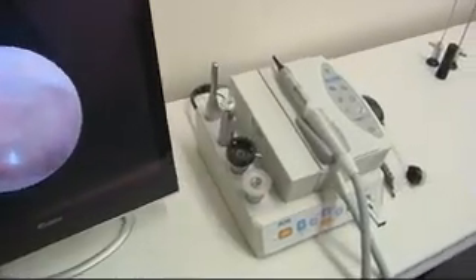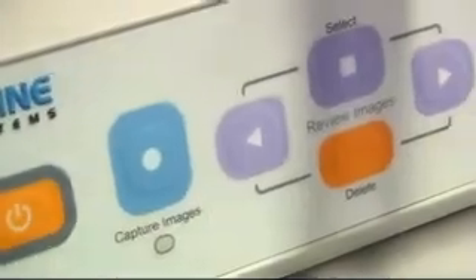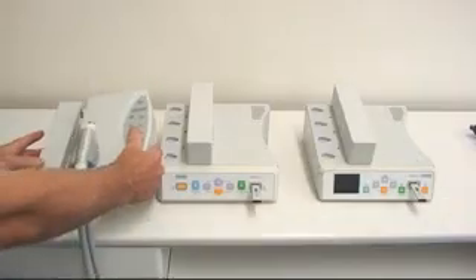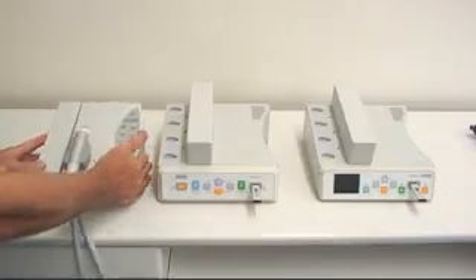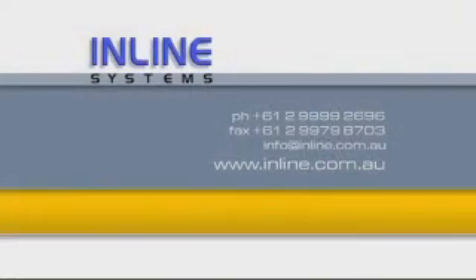The Microvision is an easy to use, six cameras in one, high resolution, compact medical camera, ideal for a number of applications ranging from ENT to dermatology and dental. The range of docking stations available make it ideal for clinical and remote use. For more information you can contact Inline Systems on 9999 2696 or visit the website at inline.com.au.